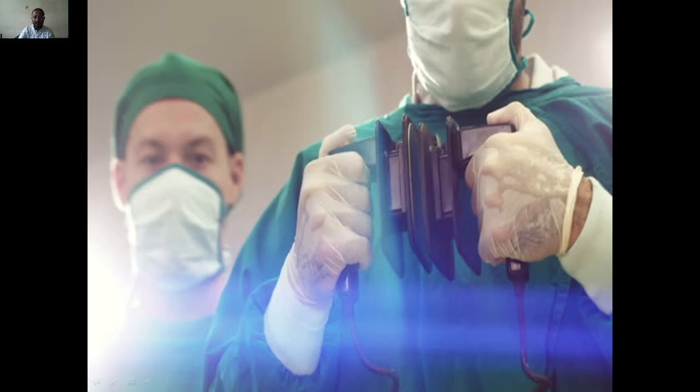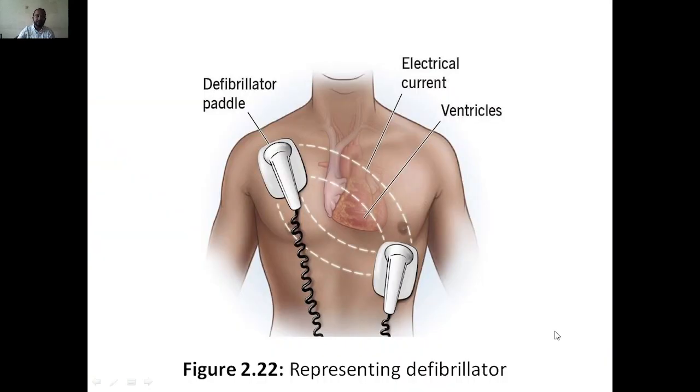And these are the connection, the electronic circuitry, where the power supply will be given from the battery. One from the upper part, one from the lower part. It will create this kind of shock waves. One will be given almost at the place where the atrium is, and another one wherever the ventricles are.